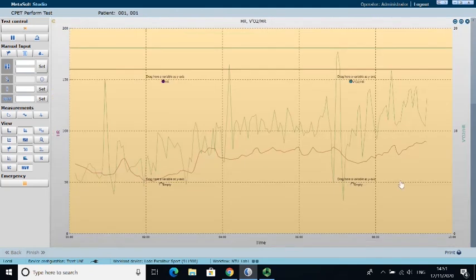And so in order to do that extra work, we need to increase our ATP resynthesis, which we don't measure but we know is the case. And then in order to increase that, we need to increase our oxygen consumption. And you can just kind of see this profile.